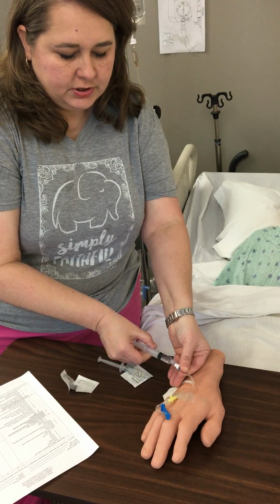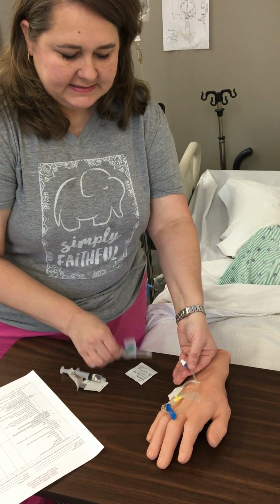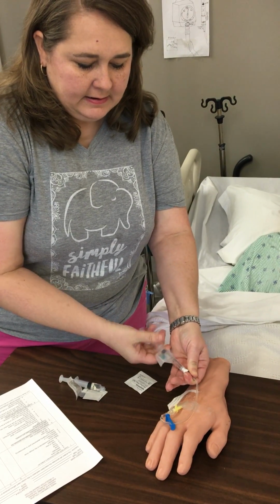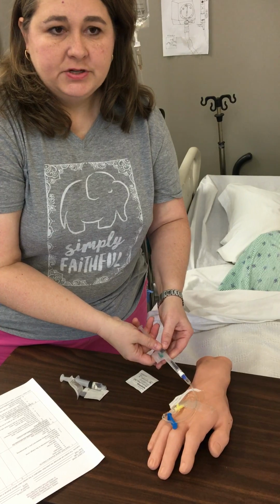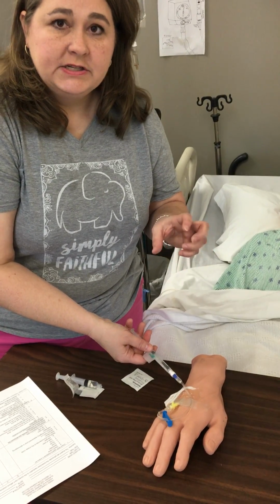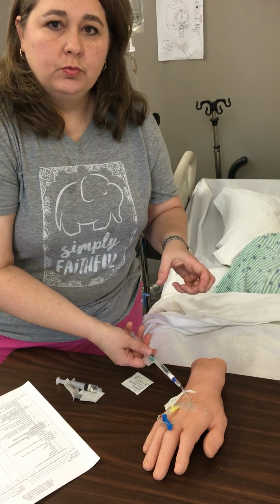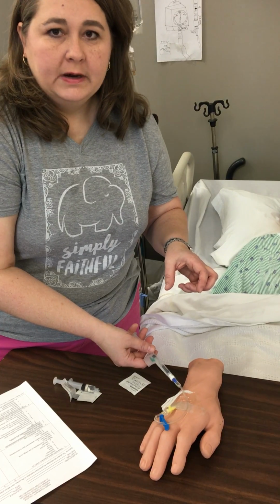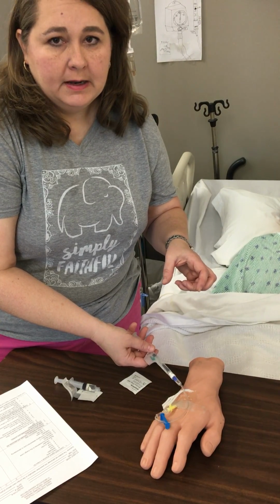remove my syringe, and at this time I'm going to push my medication at the correct rate of administration as identified in my drug handbook. You need to state ahead of time what your rate of administration is going to be, and I'm going to administer 1.5 milliliters over 1 minute.